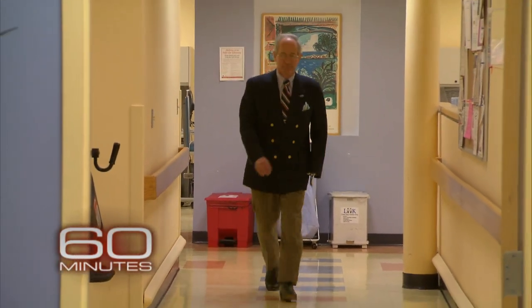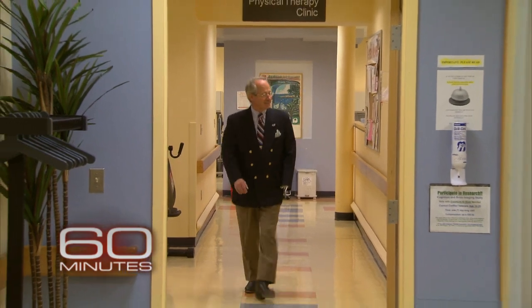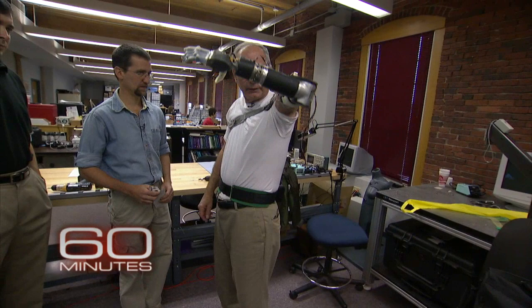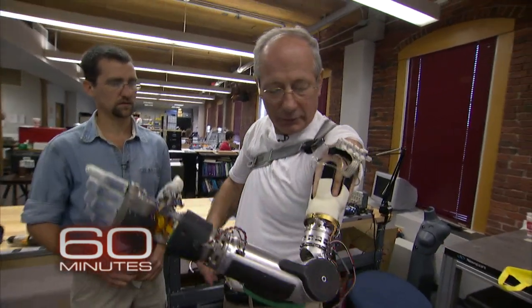When we first met Fred Downs four years ago, he was in charge of prosthetics for the Veterans Health Administration. He lost his arm while serving in Vietnam. We asked him to take off the hook that he had been wearing for 40 years and try out the DECA arm, a state-of-the-art robotic arm created by inventor Dean Kamen.